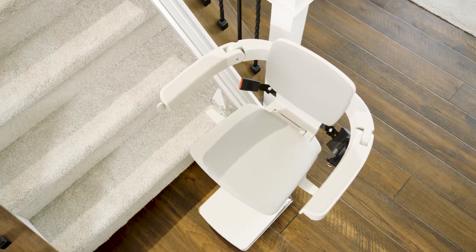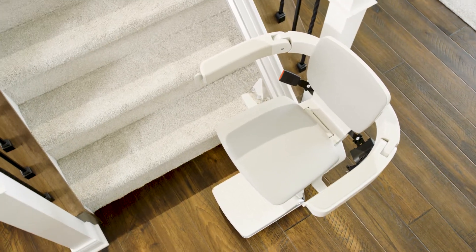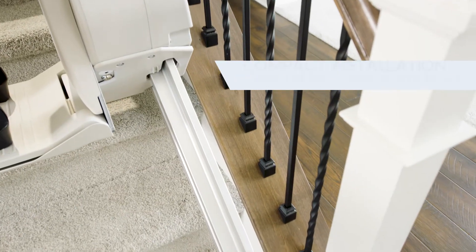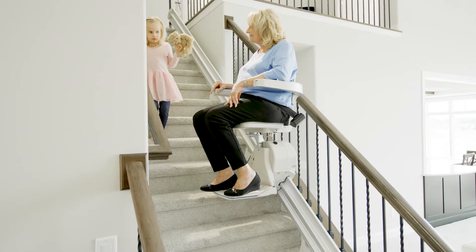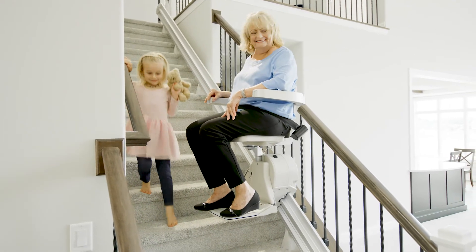Bruno's Elan Indoor Straight Stairlift blends beautifully with your home's environment. Featuring a vertical rail with covered gear rack that installs close to the wall, the Elan leaves plenty of open space on the stairs for family members.